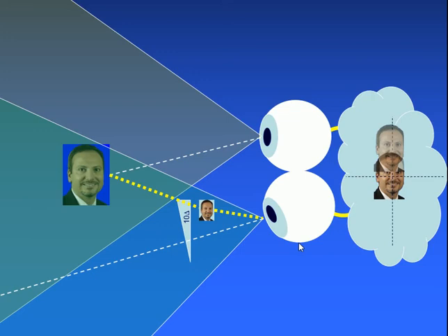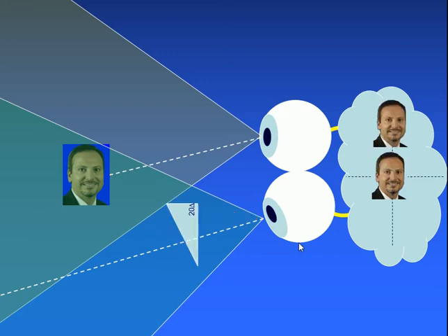So we give them a stronger prism, and in this case we see that it now brings the eyes into alignment, or brings the images into alignment, and the person sees single. So the clinician who's examining them would be able to say not only that there's a misalignment, but they would be able to quantify it and say that there's a misalignment of 20 prism diopters.